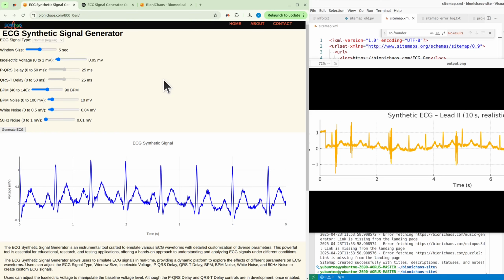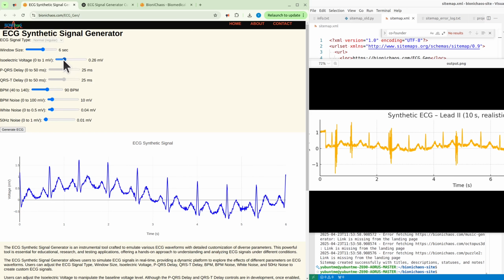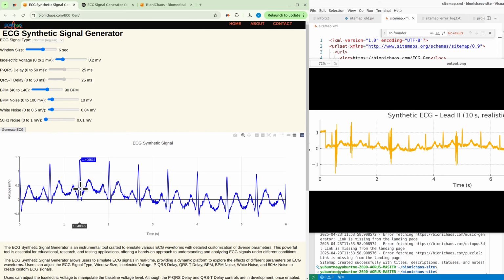Okay, so we have this ECG synthetic signal generator. You can play with a lot of parameters. This is an old one, so we covered it already multiple times, except that now we have better models that can write better code. So we'll be actually improving on it. We'll leave this one as is.